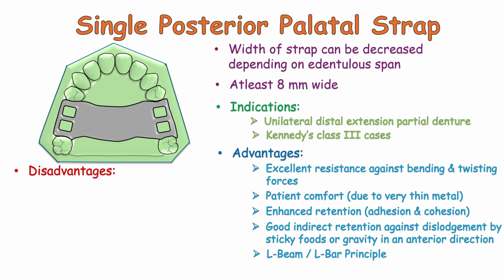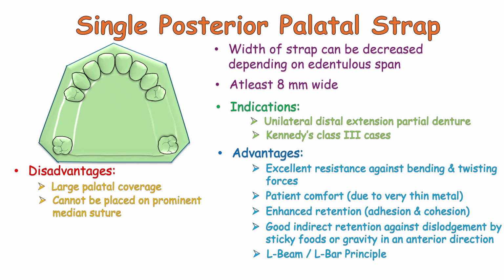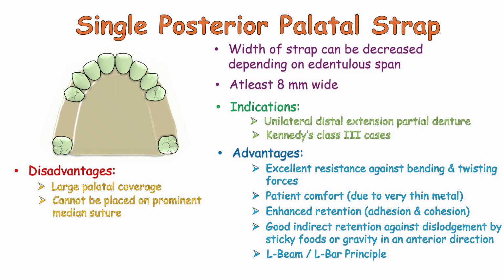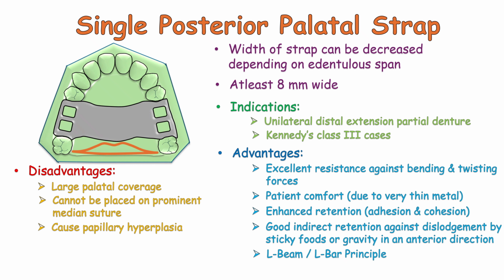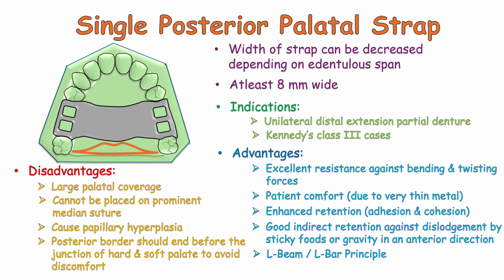Disadvantages. It has large palatal coverage and it cannot be placed on a prominent median suture. It may cause papillary hyperplasia. The posterior border should end before the junction of the hard and soft palate to avoid discomfort.